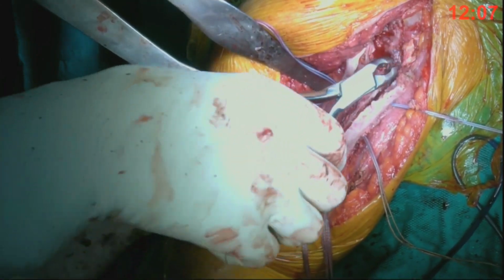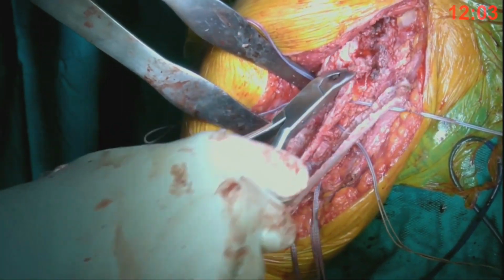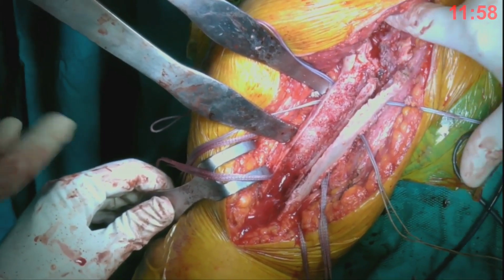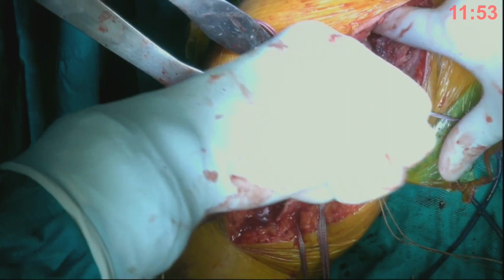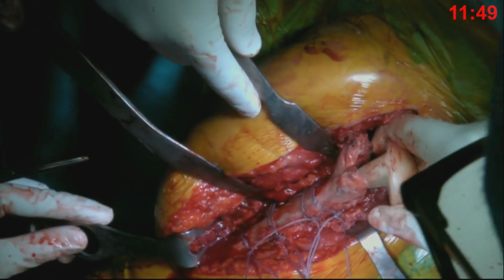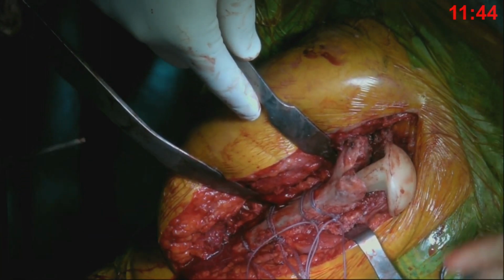I think it's a tightrope balancing act. I try and remove all the metal, but at the same time, you don't want to remove the entire glenoid vault. So I take a practical approach and remove as much metal as possible. If there's a screw that's deep in the bone that I think is likely in a non-infected area, then I may leave it, but I try and remove all the metal where possible. Dr. Antuna, what about removal? Basically the same. If the screw is deep inside the glenoid, and in order to remove it, it's going to ruin the glenoid, I will probably take the chance of leaving that part of the screw. But if it's easier to remove, I will go for it.